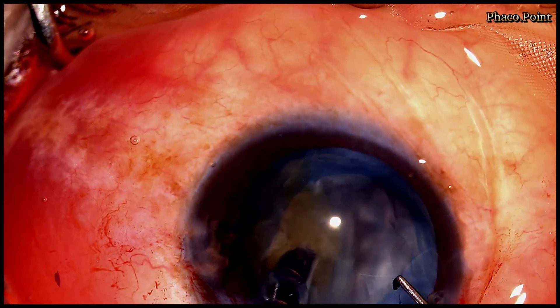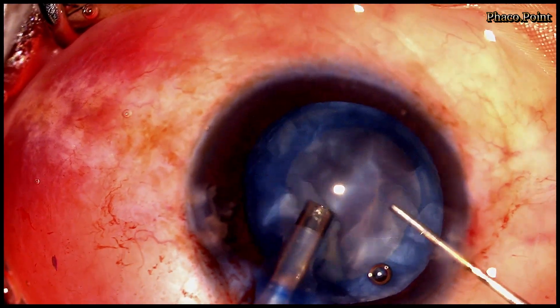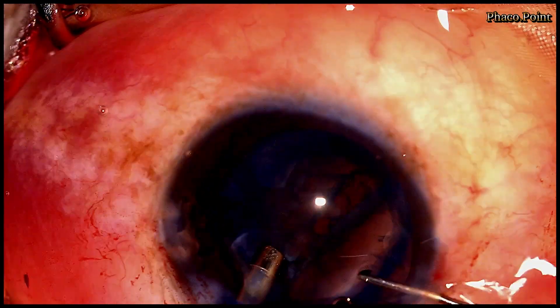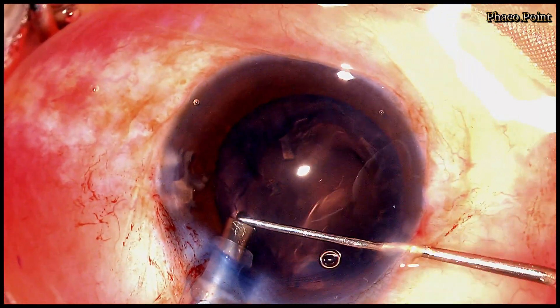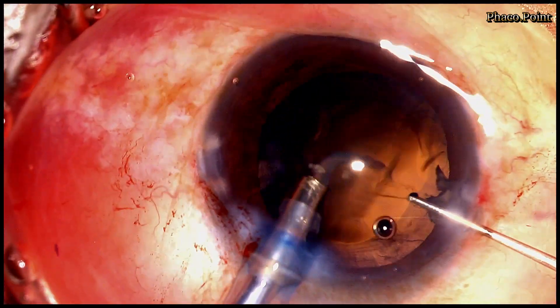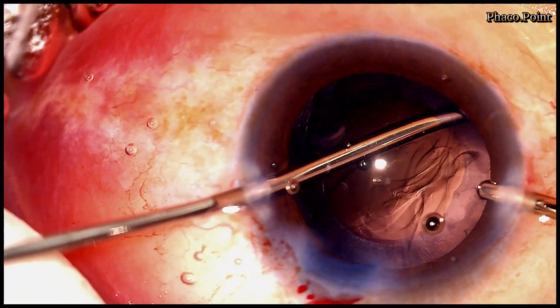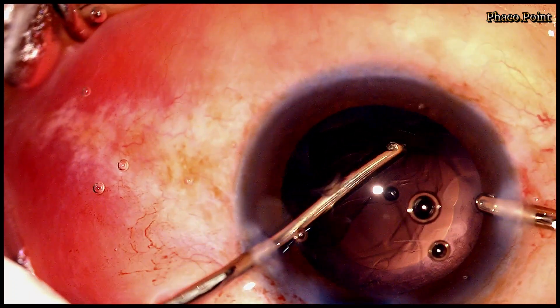We now come to the end of the nucleus emulsification. I then successfully remove some of the epinucleus with the phaco probe in epinucleus mode. The remaining residual cortex is then removed with bimanual irrigation aspiration.